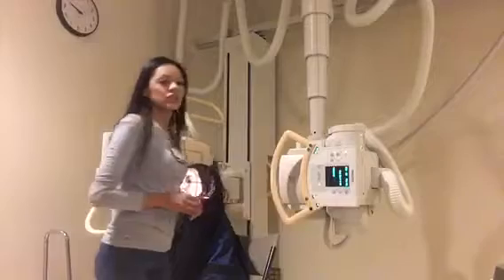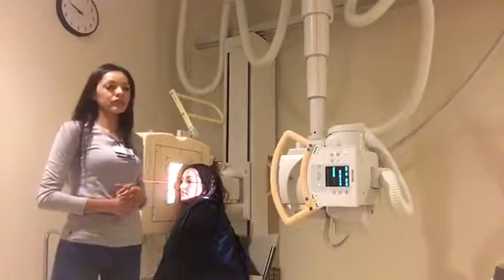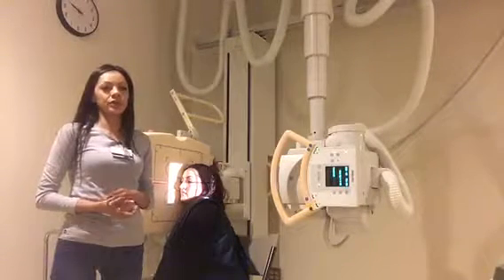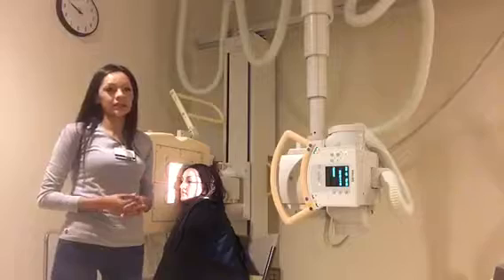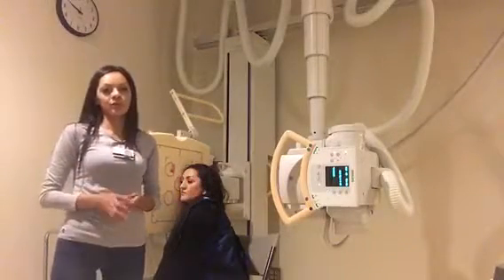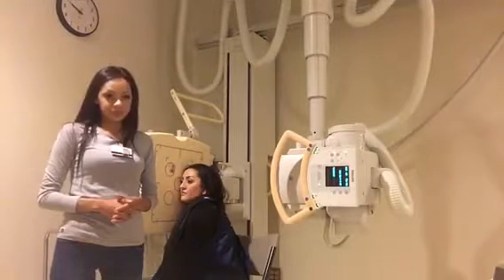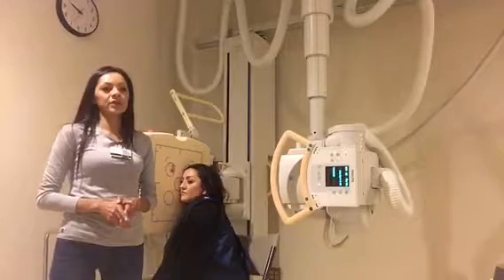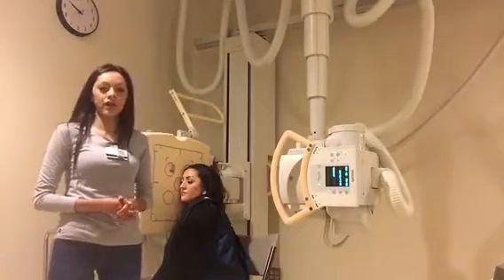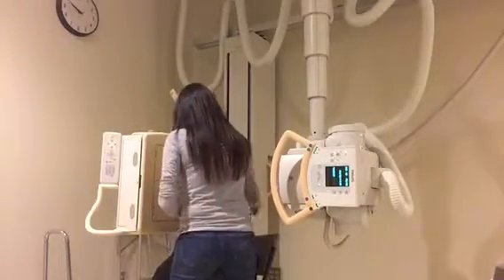So the next projection that I'm going to do is the PA Caldwell. For this projection, my central ray is going to be horizontal and it's going to be exiting the nasion. And I'm going to place a sponge to form a 15-degree angle with the IOML. The nose is going to be on the IR and the mid-sagittal plane is going to be perpendicular to the IR. So you can just go ahead and face.